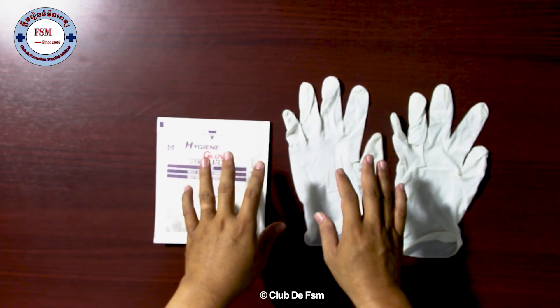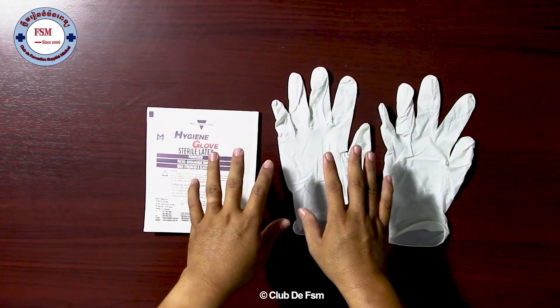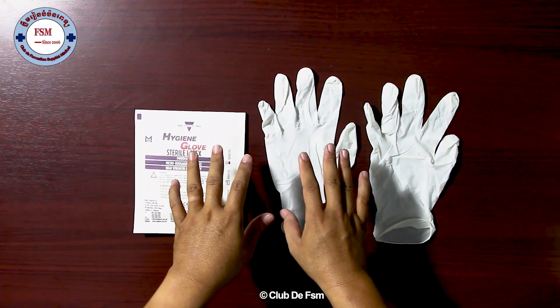Today I have one topic to present to medical students about how to perform surgical gloving.